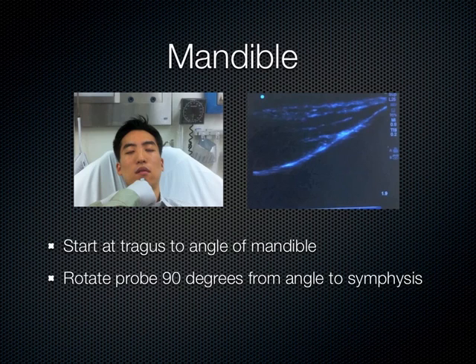That should not be mistaken for a fracture. Anytime you see one of those foramens, it looks like there's a step off, but that's just the area where the nerve comes through. You're going to scan the other side as well, especially when it's possible that a fracture could be identified. Remember, the mandible is a ring structure, and once a fracture is identified, an accompanying fracture should be sought.